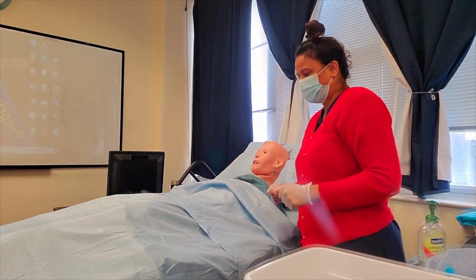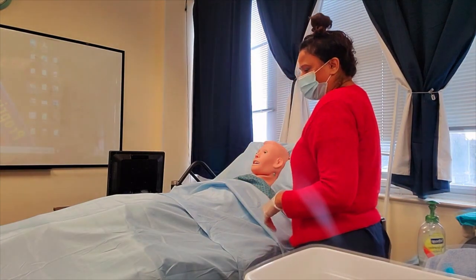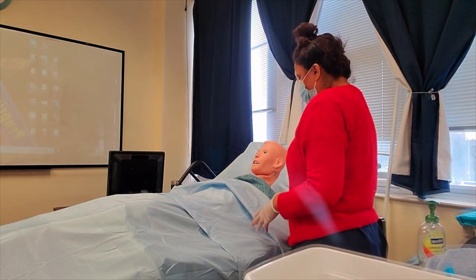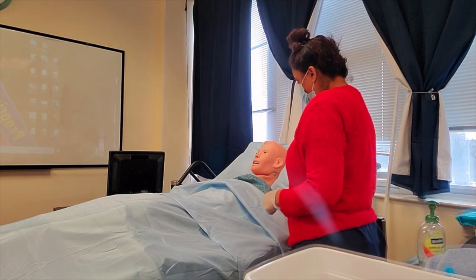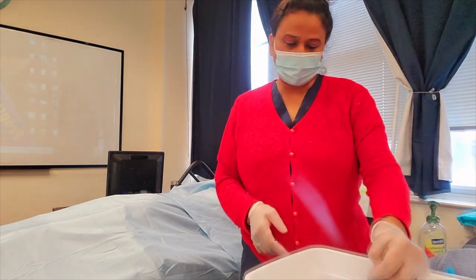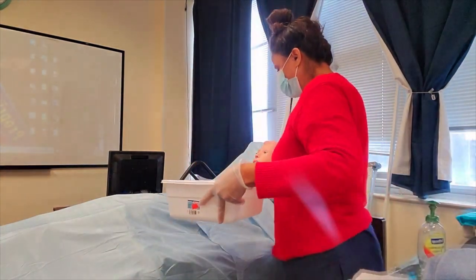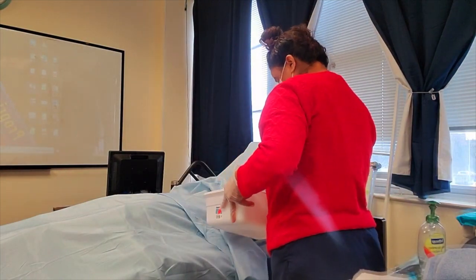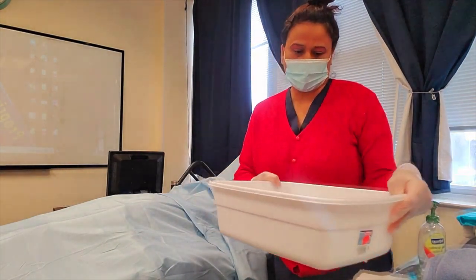Mrs. Jones, I'm going to place a protective barrier under you to protect the bed from getting soiled — is that okay? First, I'm going to let my patient check the temperature of the water. Can you check the temperature? Is it too hot or too cold? She said it's okay.